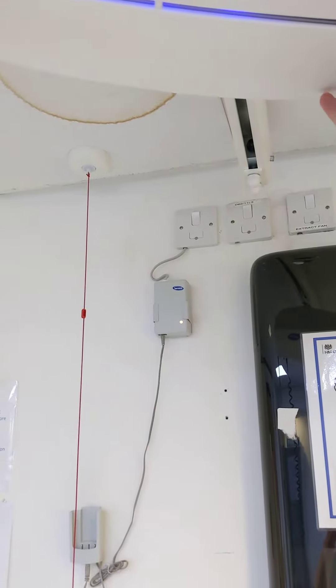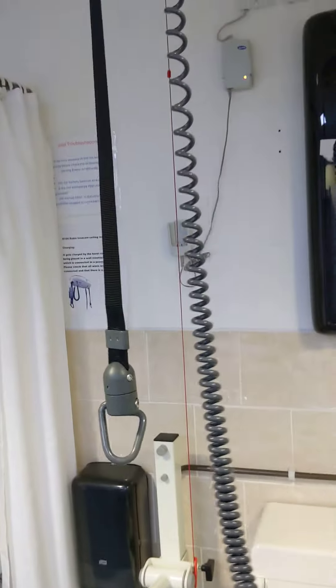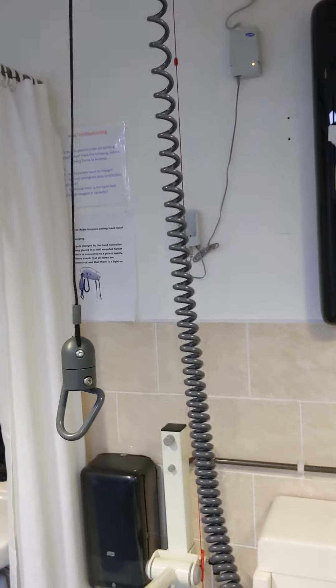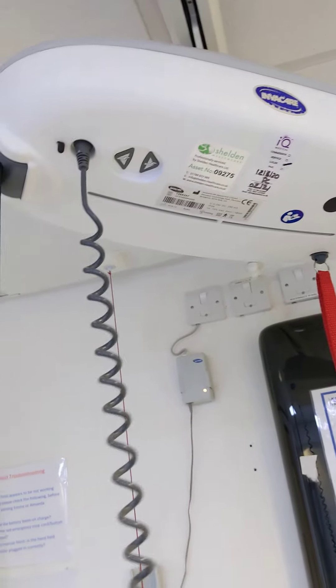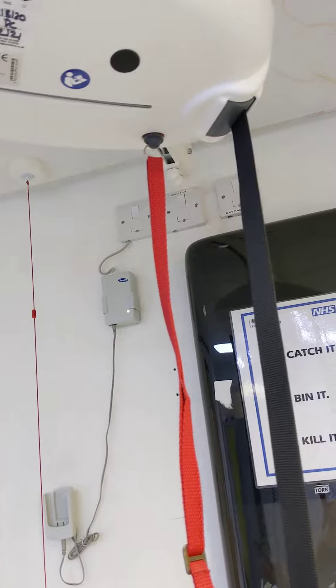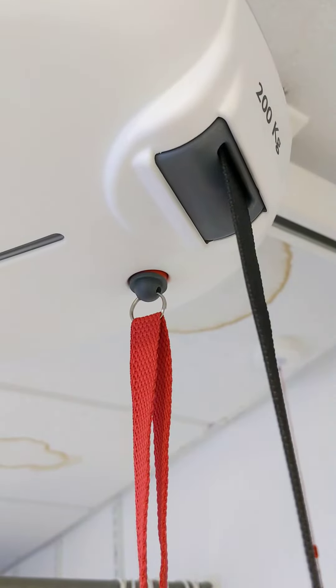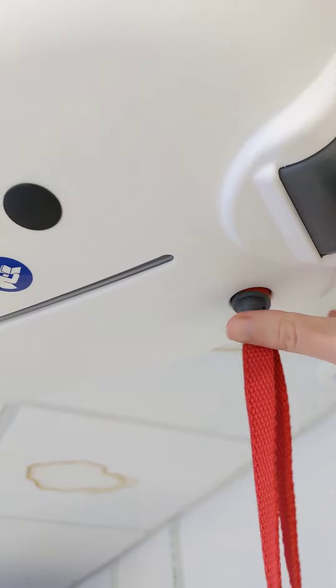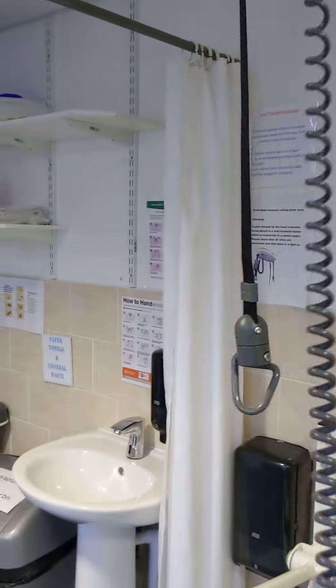I get a few phone calls throughout the year from staff saying the hoist can't move, and obviously that always panics me. But luckily most of the time it's just because the emergency stop has been activated. If you look now, it's no longer moving. From a distance you can't really tell that the emergency stop has been activated — it's very subtle. You can see it when there's a little red background bit showing. All you have to do is click it back in and then it will start working again.